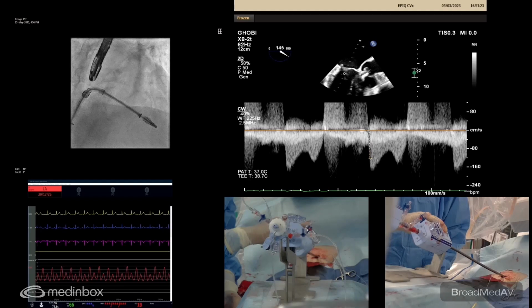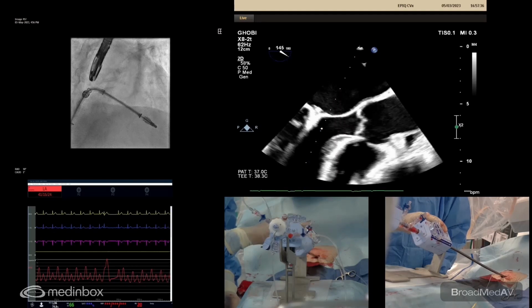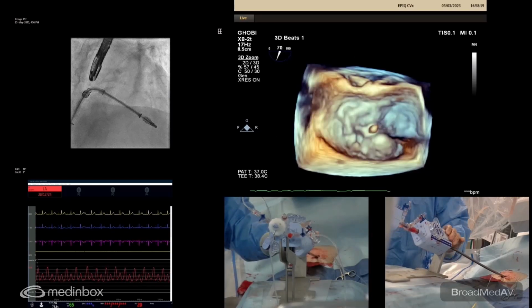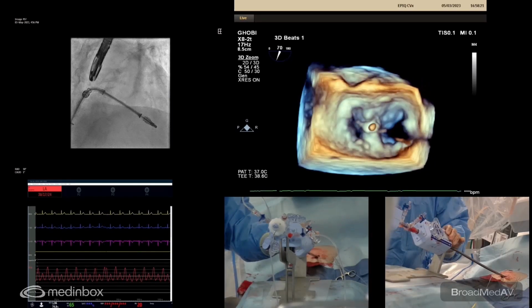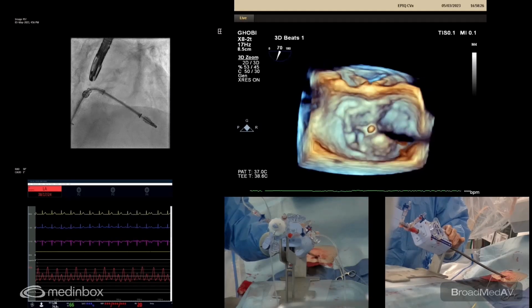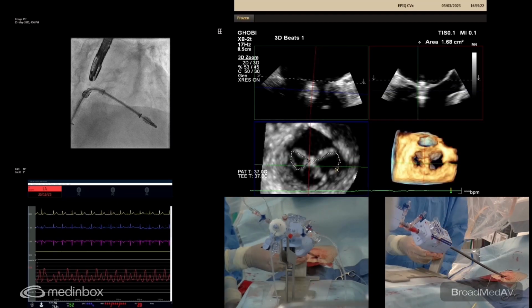The gradient looks a little bit high for me, but I still think we have to put one more clip. And I think if we reduce the MR with one more clip, the gradient will be five. Five, wow. Let's see what it is. He started off, if I remember correctly, his starting gradient was 8. Oh, that looks beautiful. You can see that we've lateralized the flail. We just have a medial side. So you can measure the orifices to see if the orifices are adequate. Gradient's 5. Yeah, it came down from 8, and I think it's okay to put another clip.